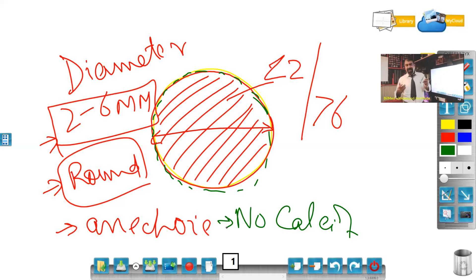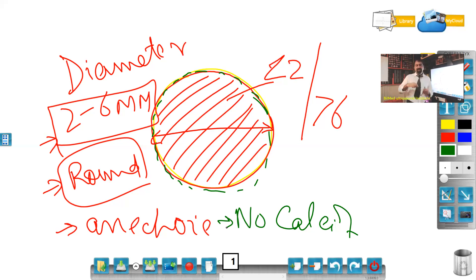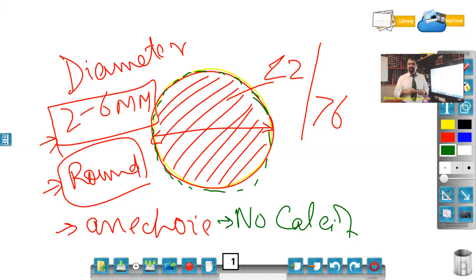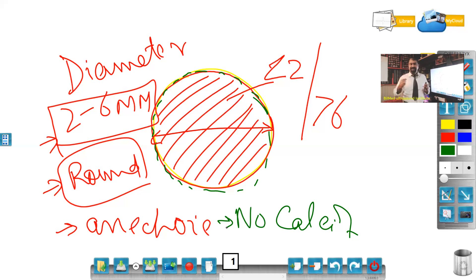And if it is a live fetus, then this fetus is at risk. If the yolk sac is less than two millimeters, I may be dealing with a dead fetus. Or if I am seeing fetal pulsations, there are high chances that this fetus will no longer show fetal pulsations after maybe two or three days. So I have to keep an eye on a fetus in which the yolk sac is abnormal.